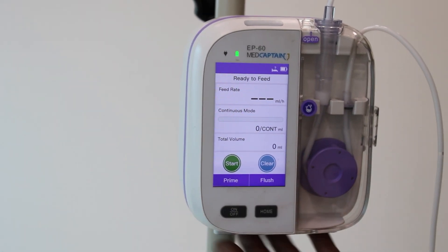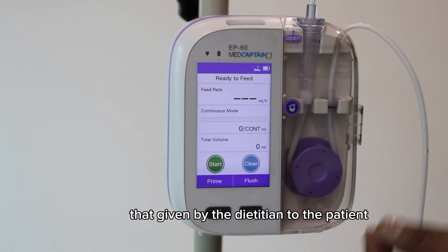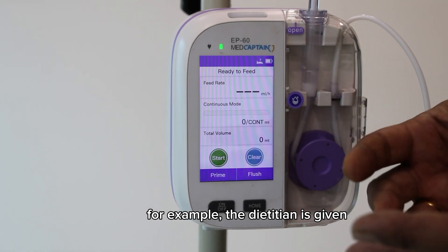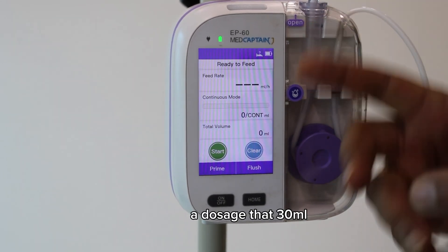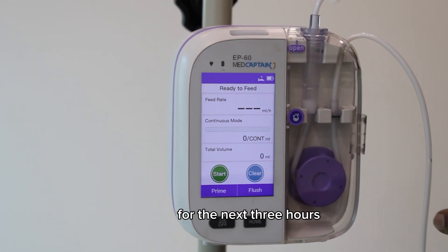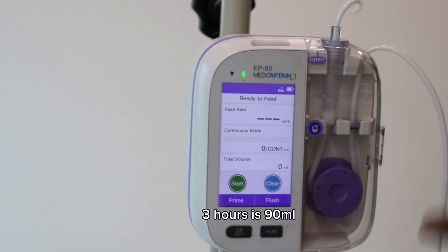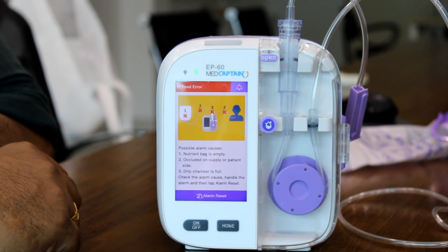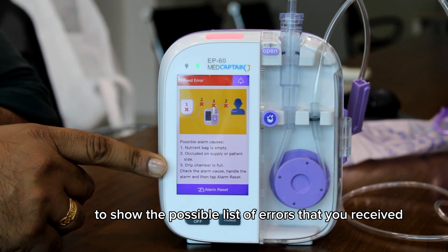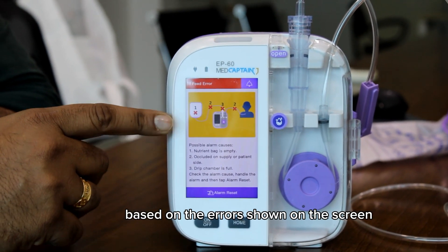Now I will show how to key in the relevant dosage given by the dietician. For example, if the dietician prescribes 30 ml per hour for three hours, that means the total is 90 ml. When the alarm is triggered, it will display the possible error details on screen, and you will be able to troubleshoot based on the errors shown.